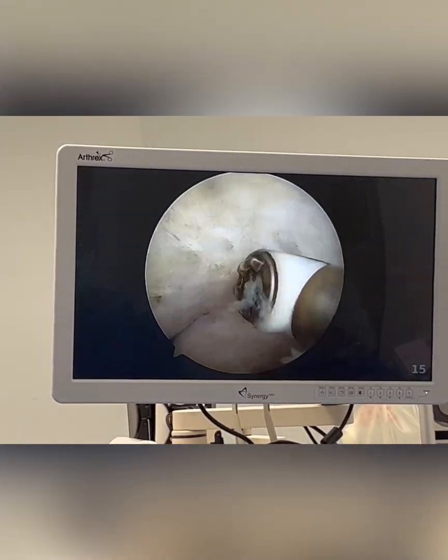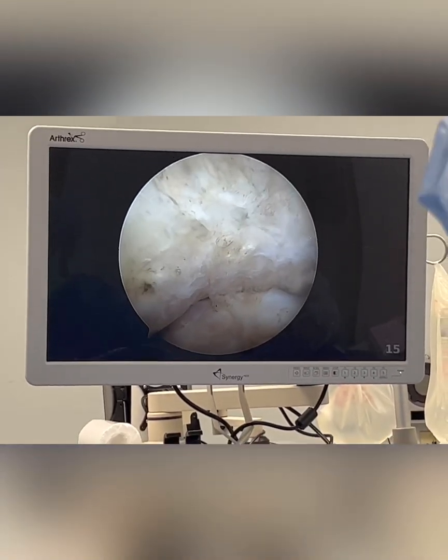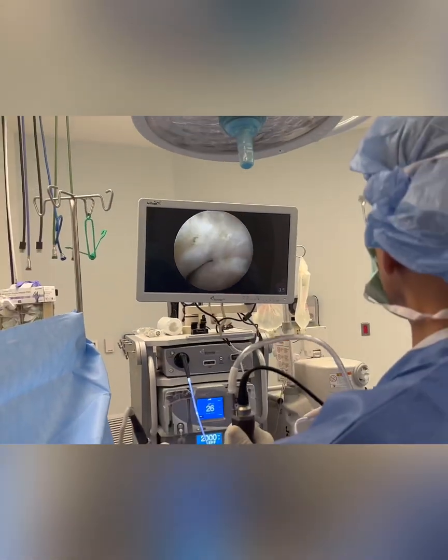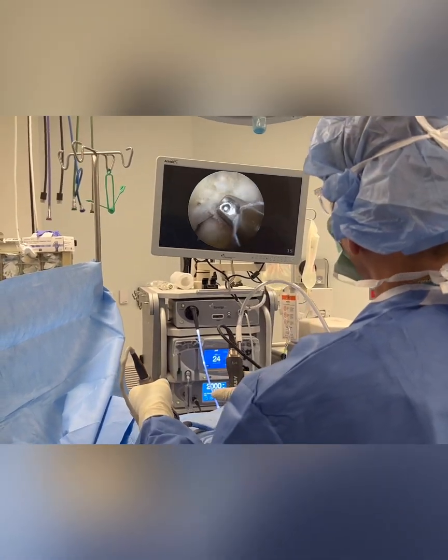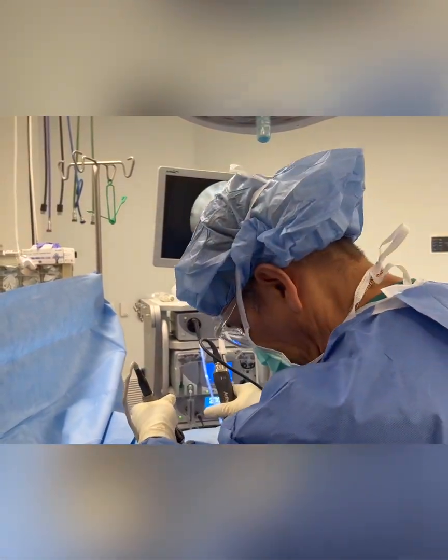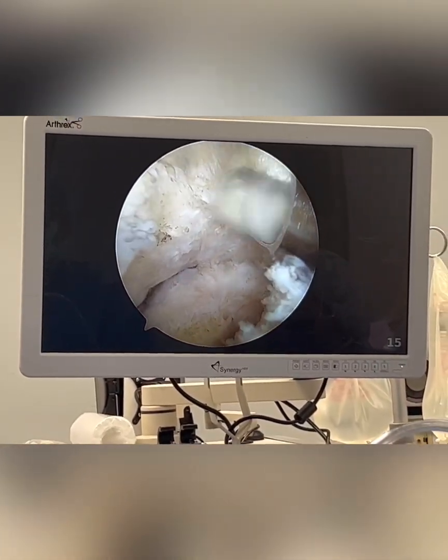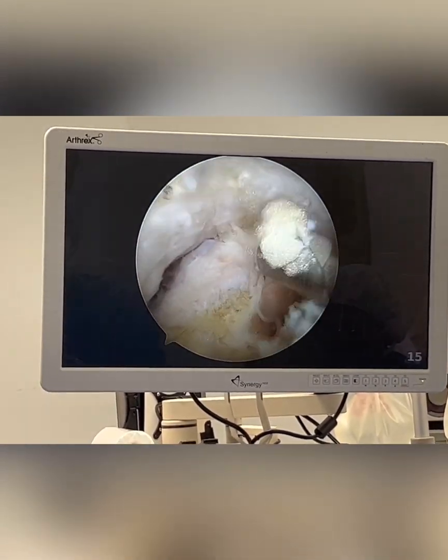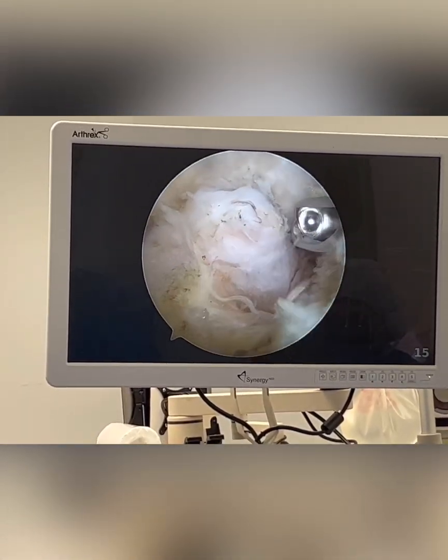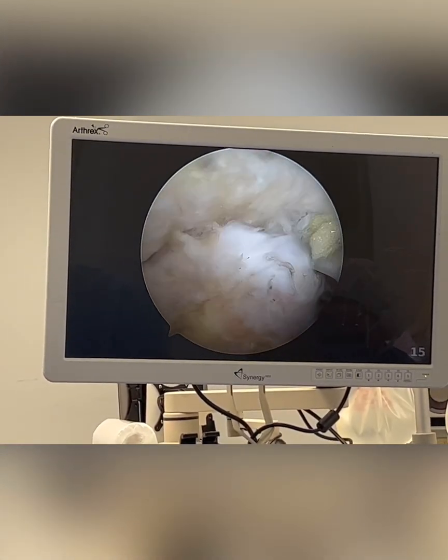It's pinching when the patient extends their elbow. So in this particular case, what I'm doing is an abrasion procedure. I have this device — it's a bone cutter type of device with bone cutting blades. And I'm going to very carefully shave down this spur right here. Maybe even break it off. Let's see.